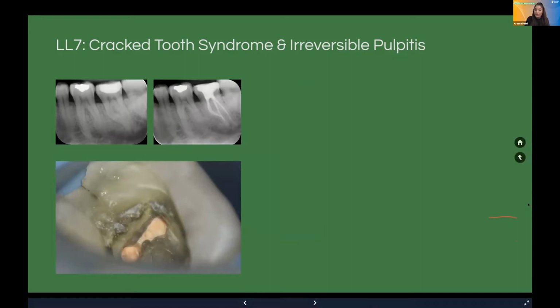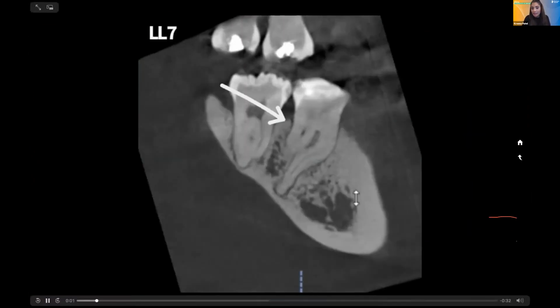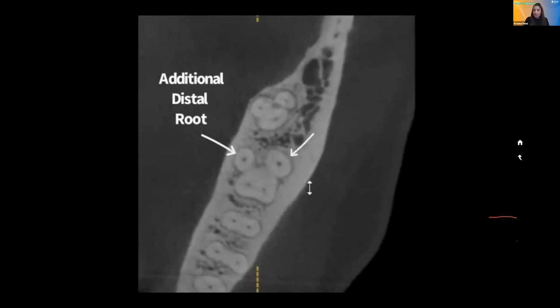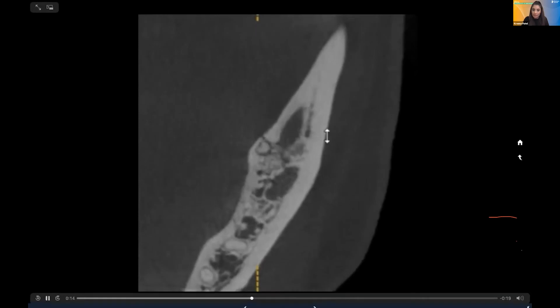But when I took my preoperative CBCT, I can also look and see if there's any distal bone loss associated with that crack. And that will help me know, even before I treat the tooth, if this crack has extended into the root. So if we look at the cone beam CT together, this is some slices that I've taken. And we can see firstly the significant curvature of the mesial root.